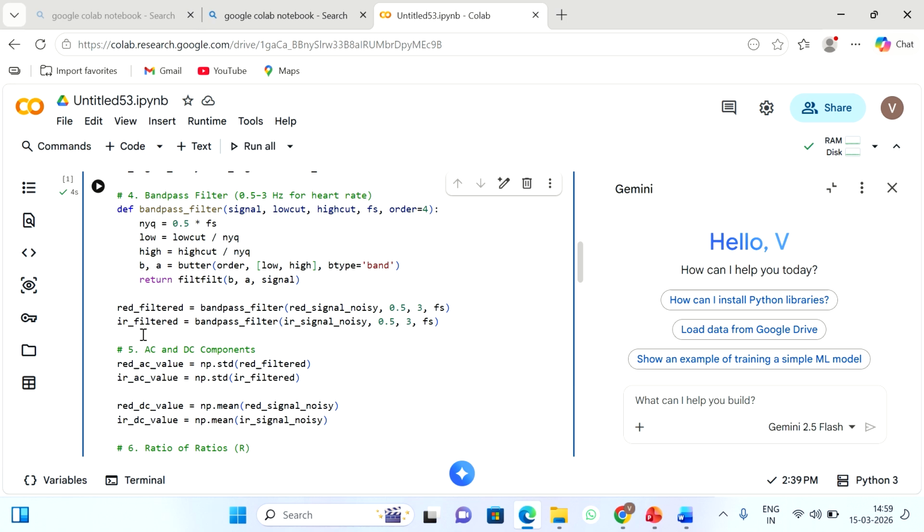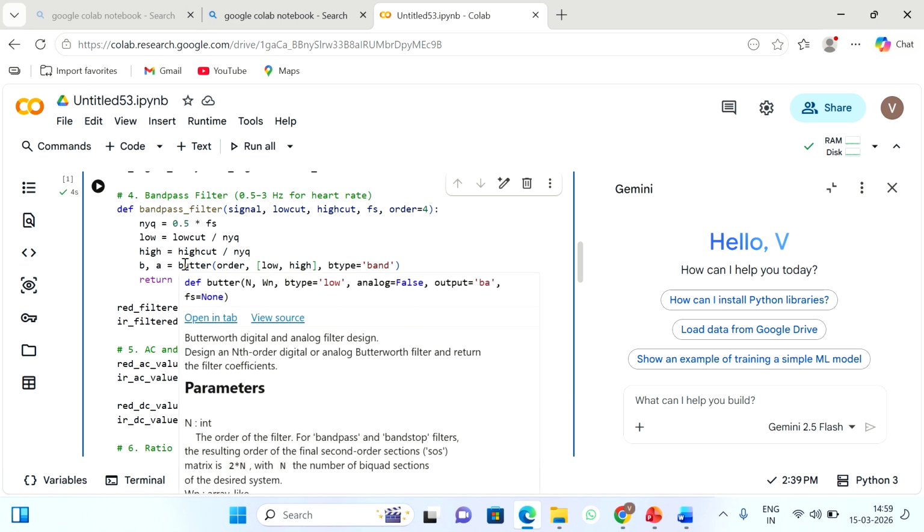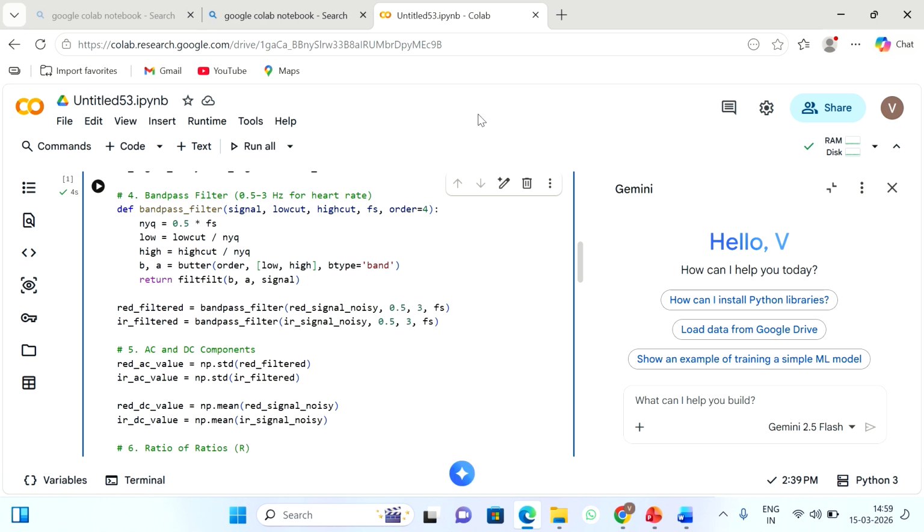It is for red filtered and then IR filtered. We have to apply it to both signals. And then the filter aims to generate the coefficients, that is, a numerator B and a denominator A. So the numerator is B comma A, and how is it generated? butter, open bracket, order. Order we know is 4. Low we have already determined, low cut by Nyquist. Nyquist means half of the sampling frequency.